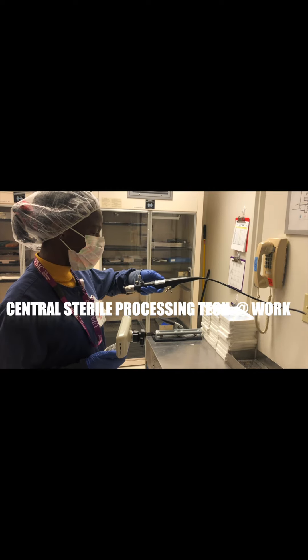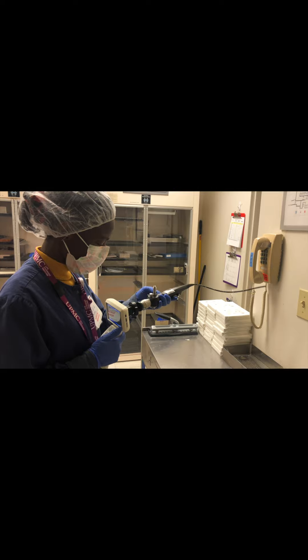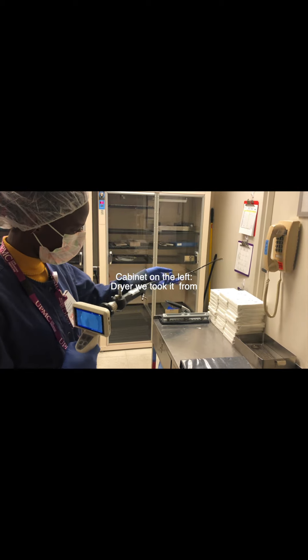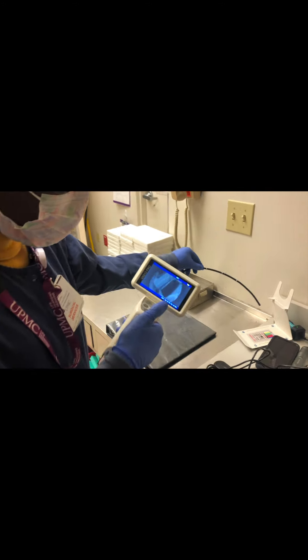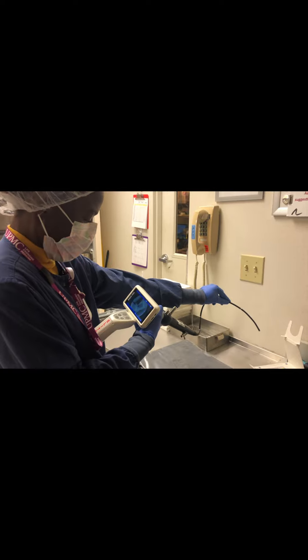This is a flexible cystoscope and I'm going to test it. I'm going to try to read something — you can scroll behind and see. I'm trying to read something here and I'm going to try to focus it better. Now I can read it better.